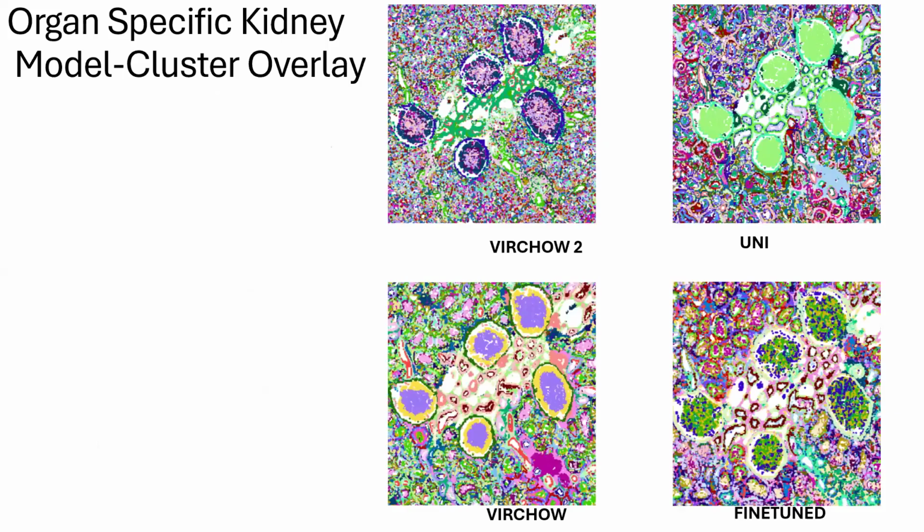So this is one of the experiments, on kidney images with Virchow 2 and UNI. The bold X structure is called glomeruli. And inside the glomeruli, in the fine-tuned version you can see some more dots. These are called podocytes and mesangial cells, because we are more focused on understanding what is inside the glomeruli. In the case of UNI, you can see only the green things.